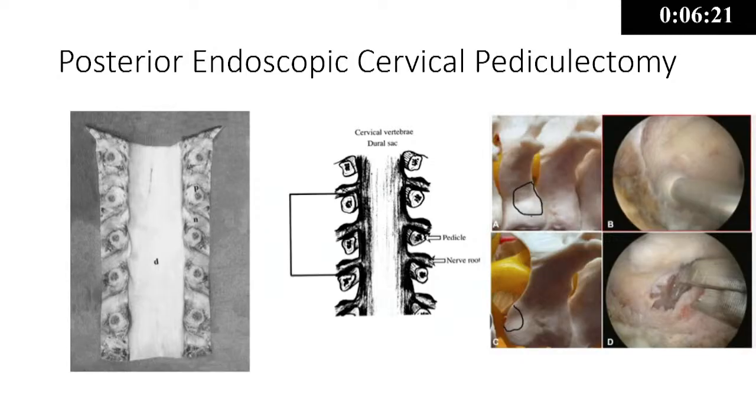Now, what amount of bone has to be removed? We have to remove this bone and this bone. But one very important thing to understand: in the lumbar spine, the roots go along the pedicle, but in the cervical spine the roots go above the pedicle. This is a very important concept. In order to free the root, we have to drill some amount of the pedicle. So there comes the concept of cervical pediculectomy, so that we can decompress the nerve root.